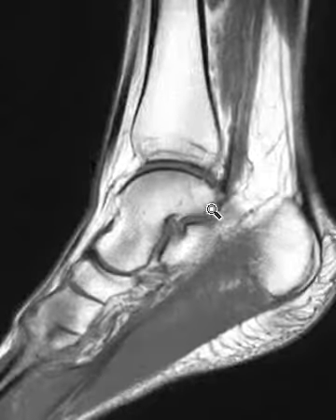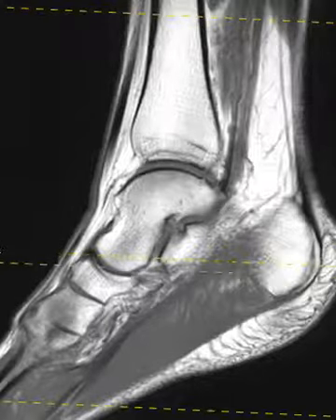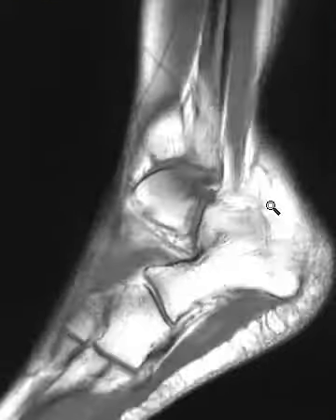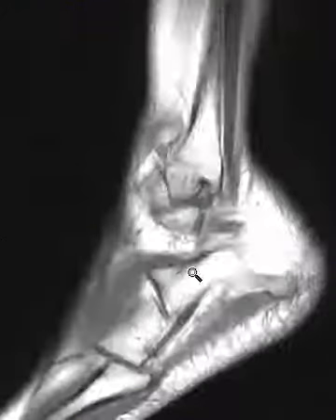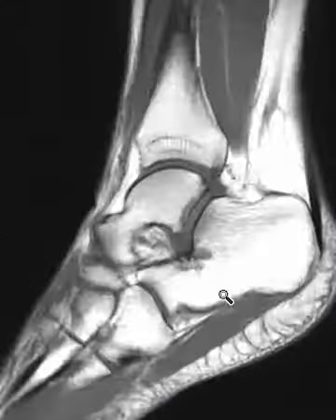And note here, when we look at the tendons, we like to put the foot down in plantar flexion because it straightens out the tendons, and we don't get that magic angle phenomenon. See, the images are more perpendicular to it, and when it curves forward, it makes a 90-degree bend, we'll get that magic angle phenomenon, and it's really hard to tell if it's tendinopathy or if it's just normal.